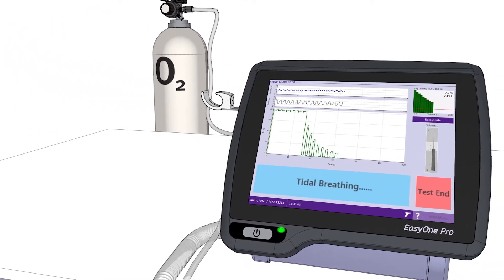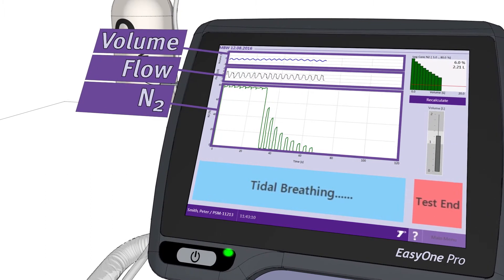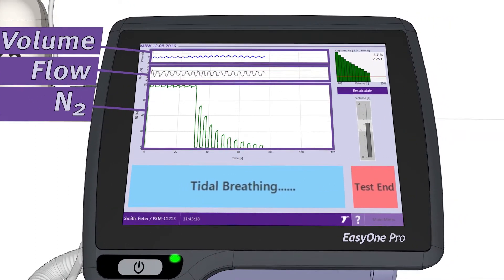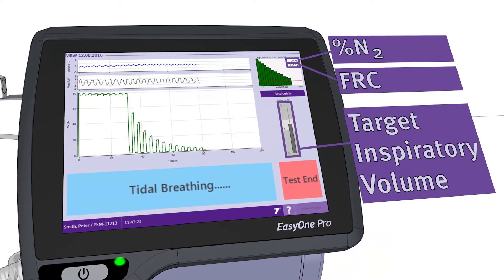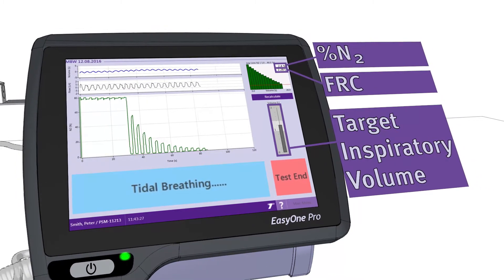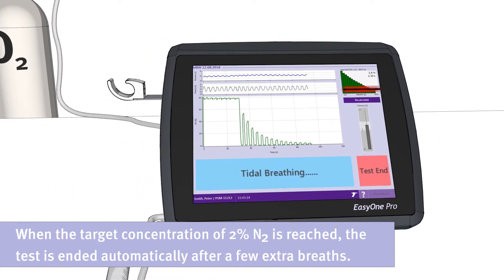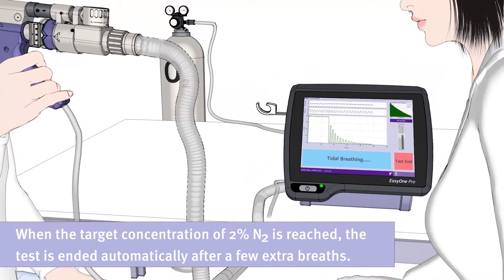These are the most important curves on the display: the breath volume, the corresponding flow, and the N2 concentration. On the right side of the screen, the following parameters are indicated: N2 concentration of the last breath, the functional residual capacity or FRC of the lungs, and the target inspiratory volume. When the target concentration of 2% N2 is reached, the test is ended automatically after a few extra breaths.